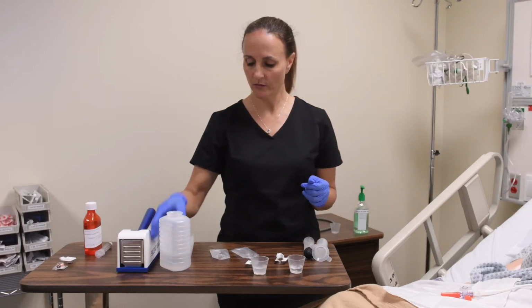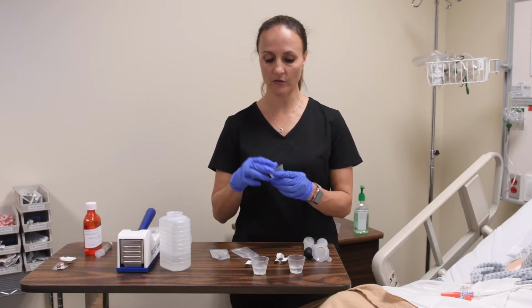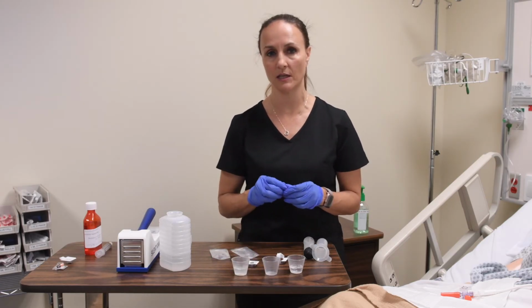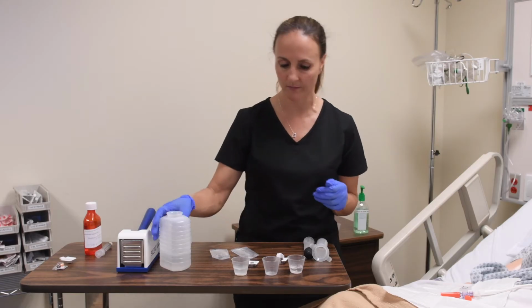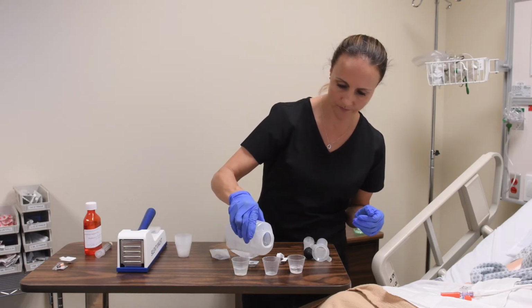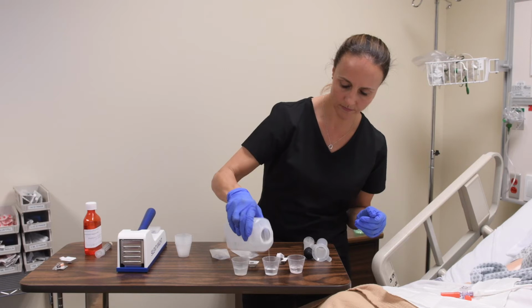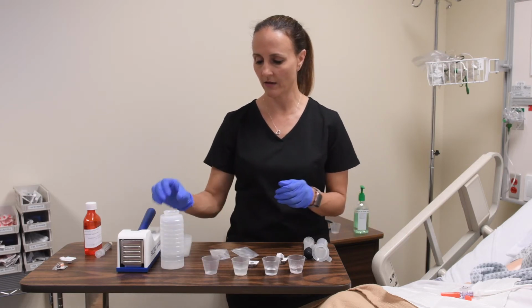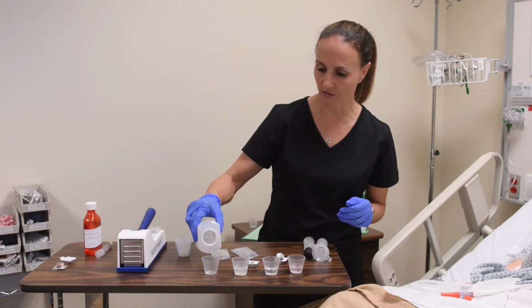What I'm also going to do is make sure that I have another cup in between the medications, because you have to flush with 10 to 15 mLs of water in between each med. And then I'm also going to make sure that I have 30 mLs of water at the very end.